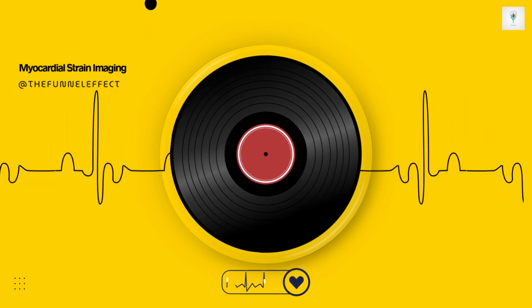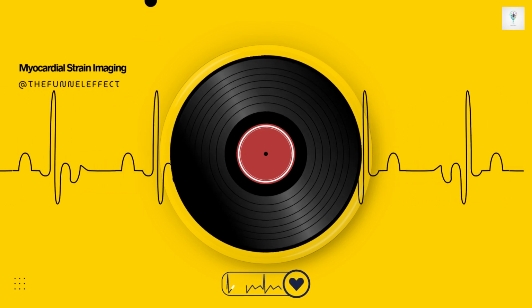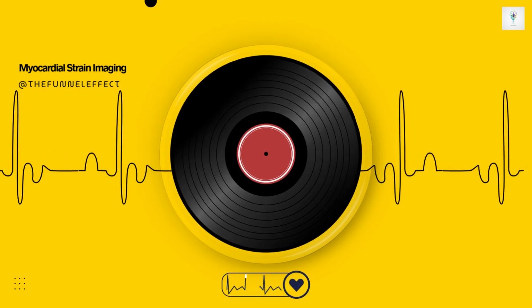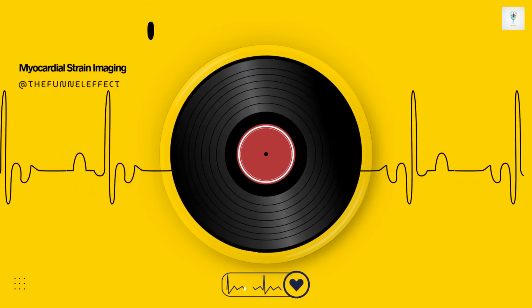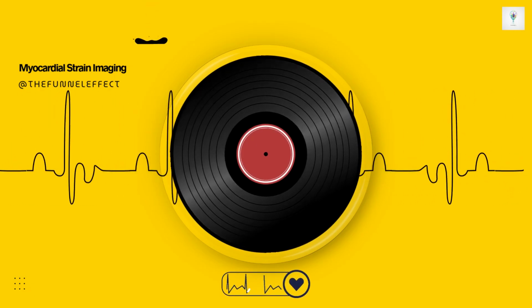But it wasn't perfect. You mentioned drawbacks, especially for diastole. Right. The main issue is that those magnetic tags don't last forever. They relax or fade over time during the cardiac cycle. When does that become a problem? Specifically in early diastole, the relaxation phase. If a patient has a slower heart rate, the tags can actually disappear before the diastolic filling phase is even complete.